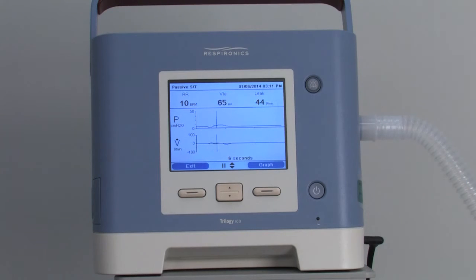Work with your respiratory care practitioner and physician to determine what settings are most comfortable for your child with mouthpiece ventilation. The Respironics company does have specific part ordering numbers, one that provides you with the actual mechanical arm to hook to a wheelchair if the child is in a wheelchair perhaps, and hold the mouthpiece near their mouth. In addition to that, they have the circuitry, which would be provided by your durable medical equipment company.